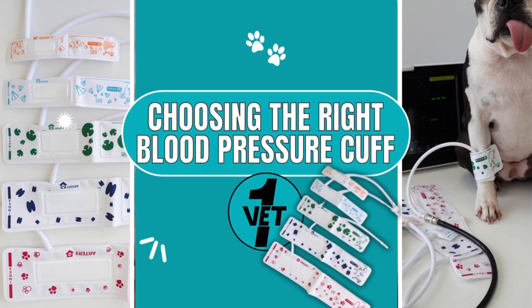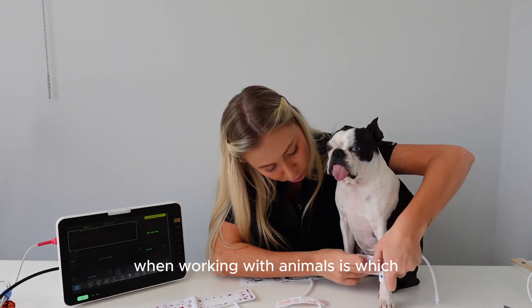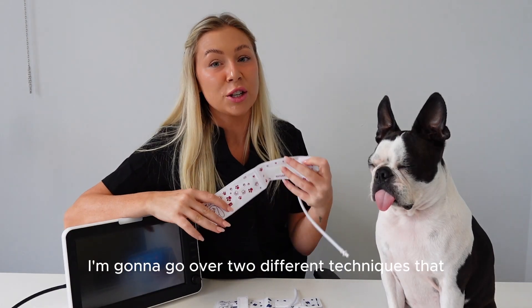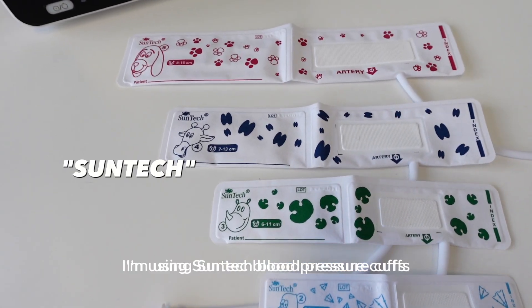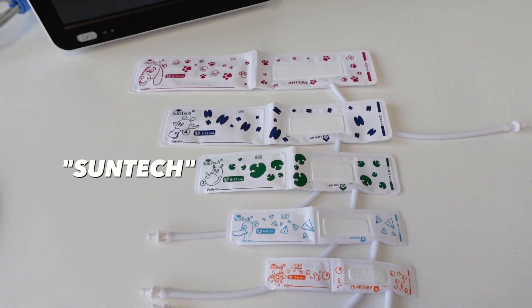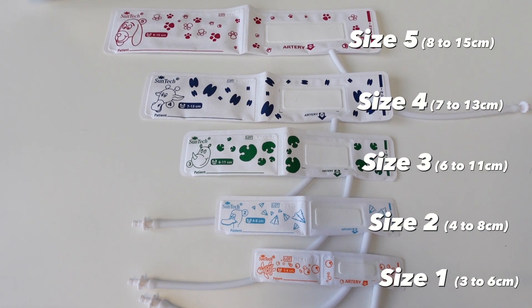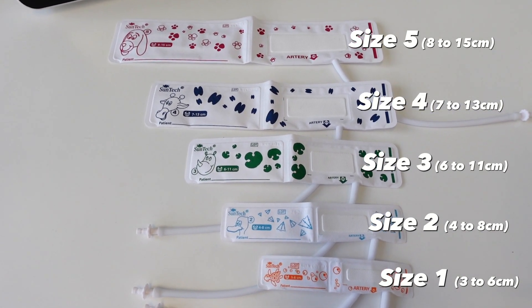In this video I'm looking at blood pressure monitoring cuffs. The most difficult thing when working with animals is which cuffs you should be choosing for each individual patient. I'm going to go over two different techniques to figure this out. I'm using SunTech blood pressure cuffs — I've got five different sizes labelled one through five with their different measurements, which will help determine which one you're going to choose for the patient you're monitoring.